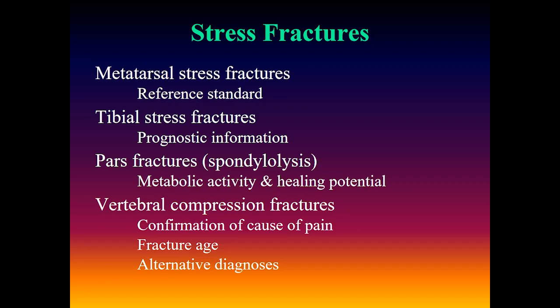In patients with vertebral compression fractures, the bone scan can confirm that, in fact, the compression fracture is the cause of the patient's pain. It can help determine the relative age of the fracture, i.e. acute or remote. And finally, it can provide alternative diagnoses to explain the patient's symptoms.